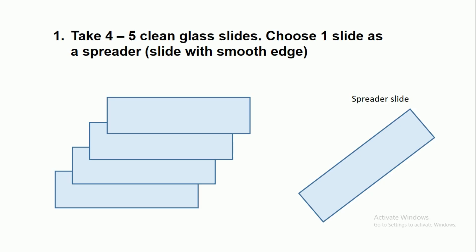Take 4-5 clean glass slides as we are going to prepare multiple smears simultaneously. From these slides, choose one slide as a spreader. The spreader slide must have a smooth edge.